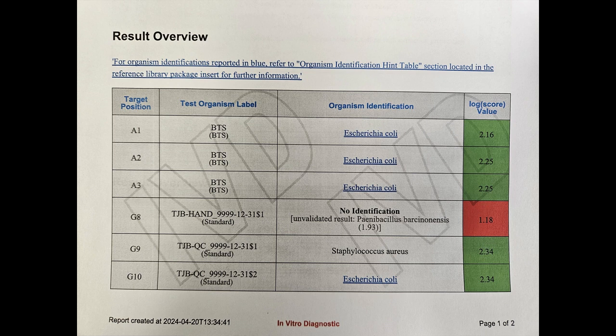This is okay in some cases, but it's not great when you want to know what's going on and have an accurate identification. Sometimes when the read is not great, it has a lower score, the dot may turn red. This is more common with contaminating organisms and organisms not clinical in nature.